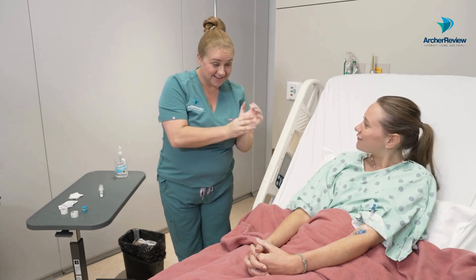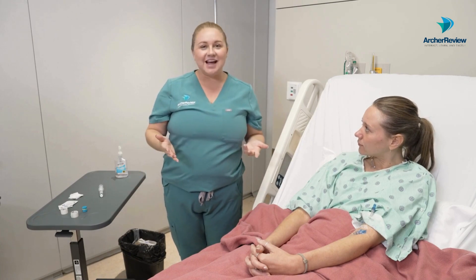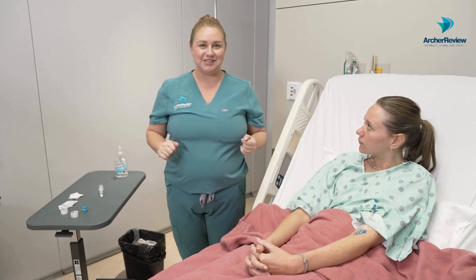Feeling okay, Ms. Caffrey? Feeling great. We'll go ahead and lower the bed to the lowest position, raise the side rails, make sure the call light is within reach, and document the entire procedure.